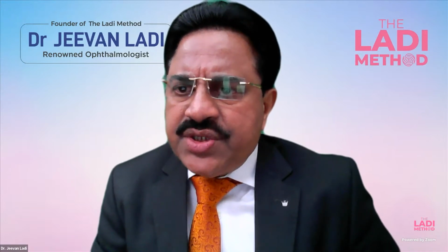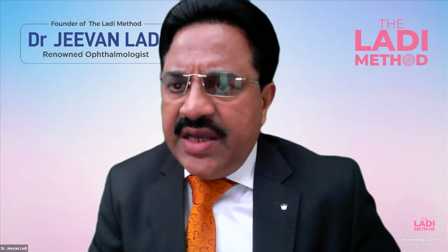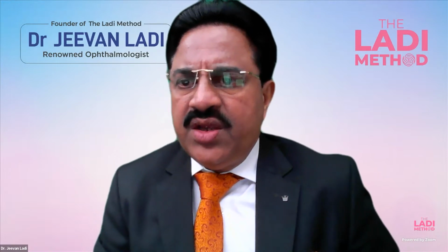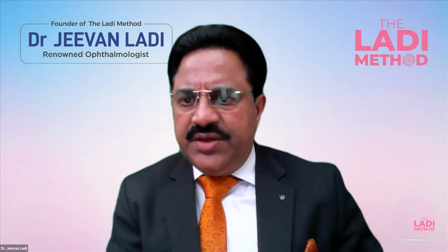For secondary IOL patients, yes, if you are doing a secondary IOL, it means that the patient has come to you in aphakic mode, so you can select aphakic mode and calculate the secondary IOL power. Yes, easy.